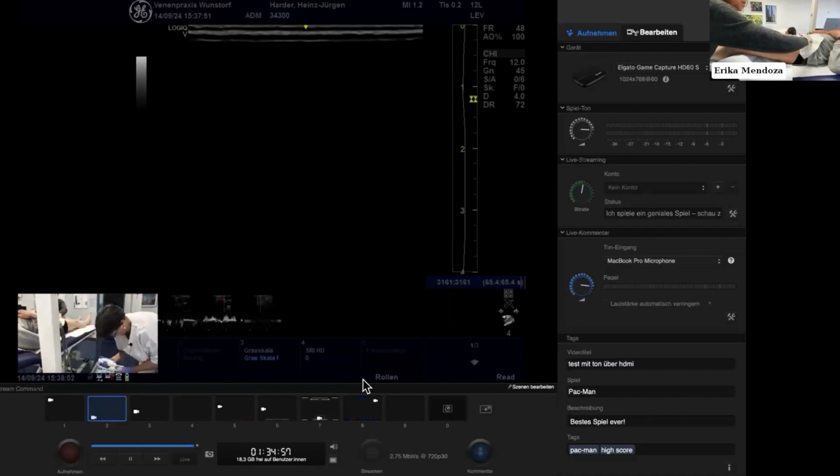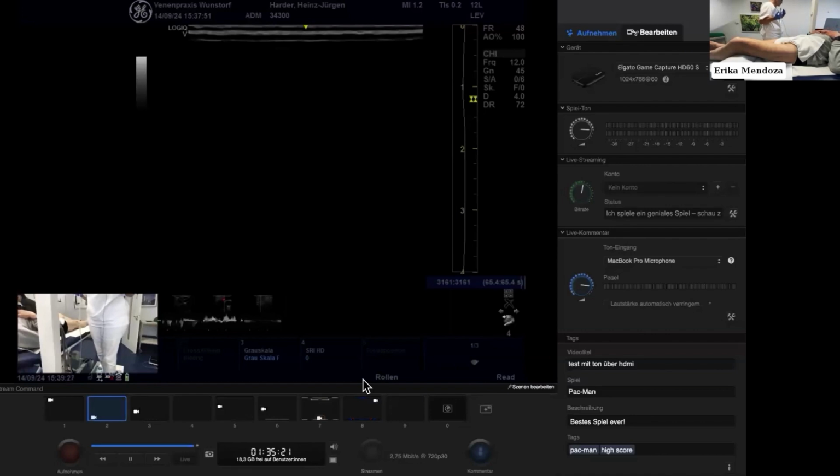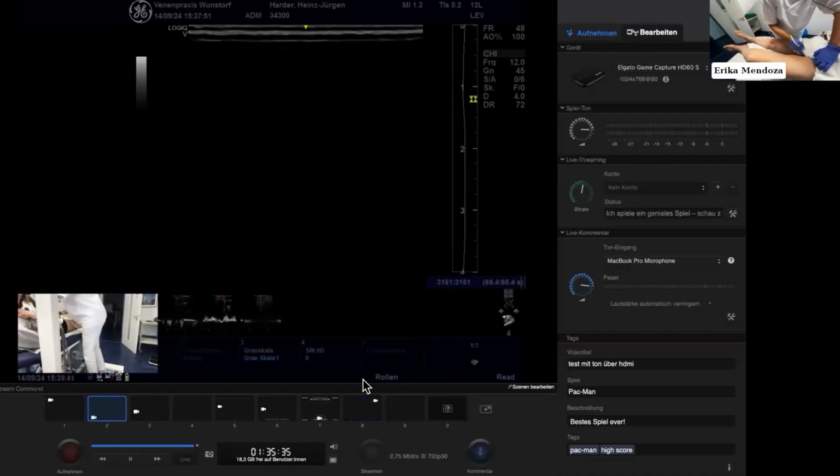And Erika, we're ready. Yes, so we didn't have that prepared, so we had to do so. I took a 2 ml, 1 ml ampoule of adrenaline, and I diluted it in 20 mils of saline, and I took 4 mils of these into 1 liter of saline. So I have diluted it to 1 to 0, 0, 0, 0, lots of zeros there. So to have a really diluted concentration of adrenaline. And that's now 1 in 4 million.